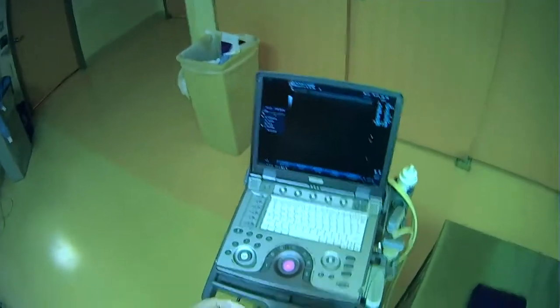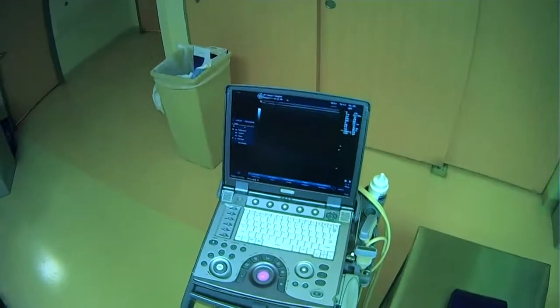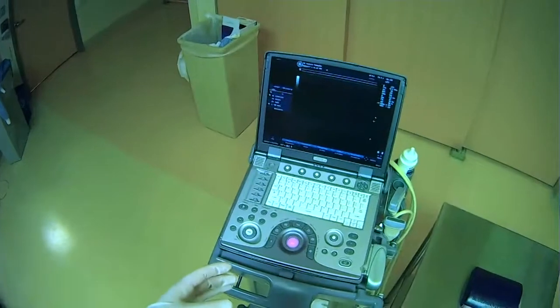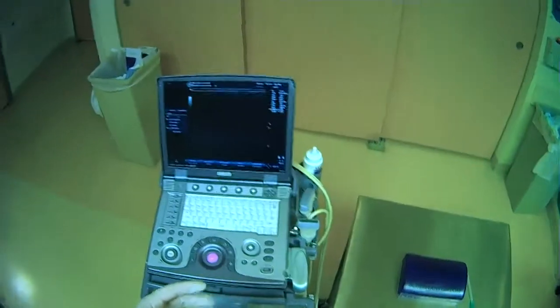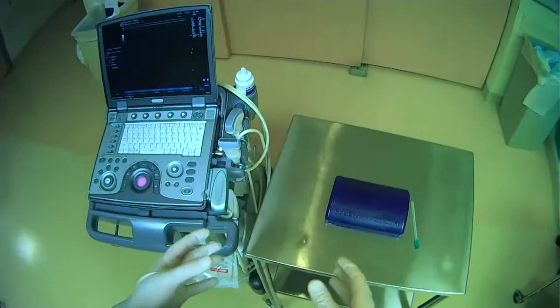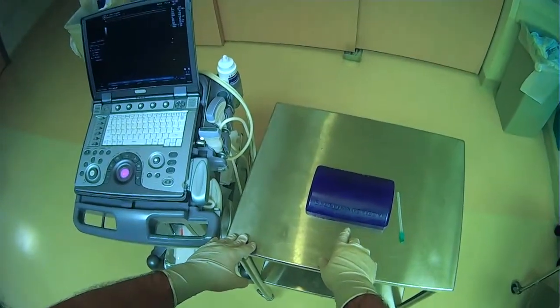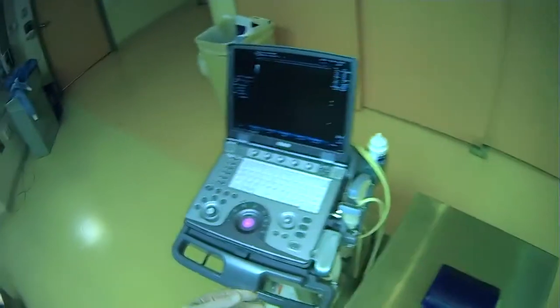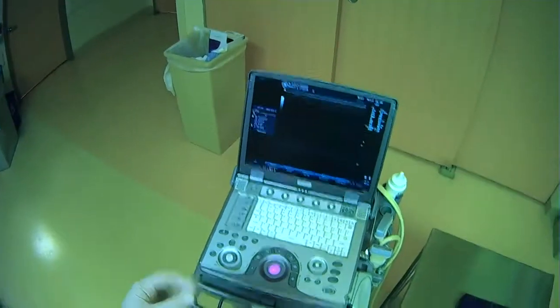After you have your equipment together and you've found the right ultrasound machine and probe for you, you want to make sure that you position the machine in such a way that your procedure will be as easy as possible. For our purposes in these videos, we're going to be using this little model as our target surface, and we have to make a decision about where we want to actually place our ultrasound machine.